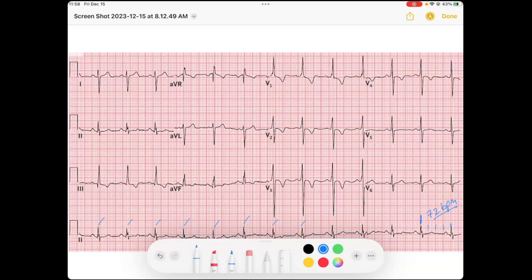Let's see what the atria is doing. We'll go up to lead one and look at our P waves. We've got P waves that appear to be occurring throughout, and our P waves are up in lead one and up in AVF. If they're going towards lead one and towards AVF, we know the P-wave axis is going down to the left, so we can say that this is a sinus rhythm.